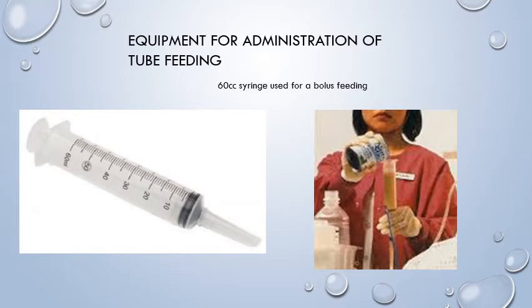A bolus feeding to provide water, medications, water, supplement, doctor-ordered water flush will take about 15 minutes to administer. A bolus feeding can be done with a G-tube or a Mickey. Flushing the tube helps to prevent the tube from becoming blocked.